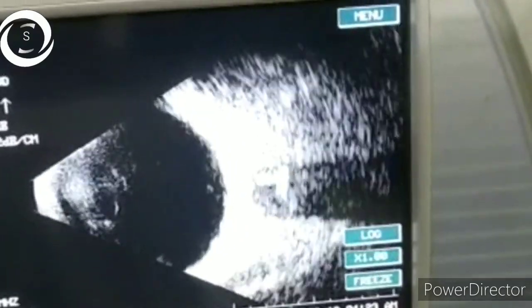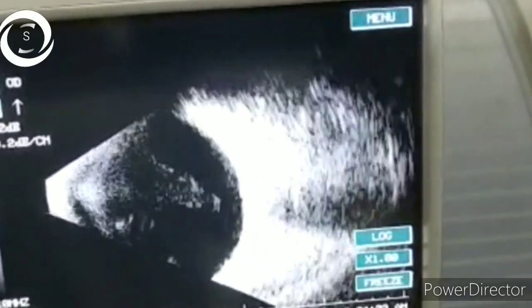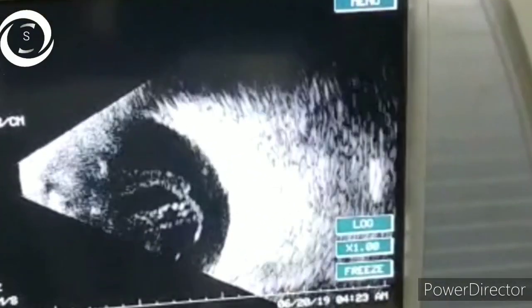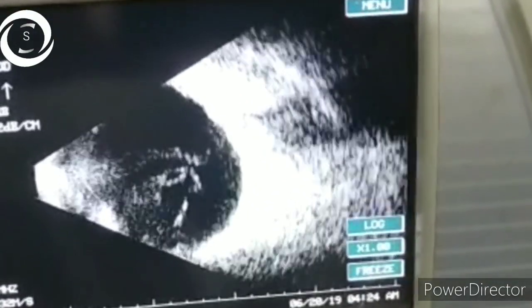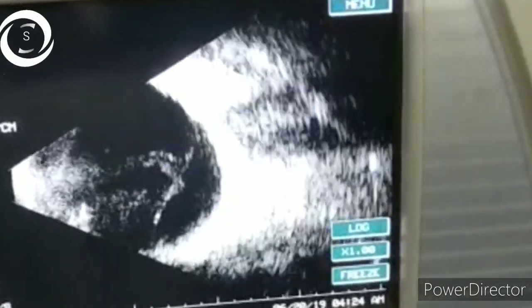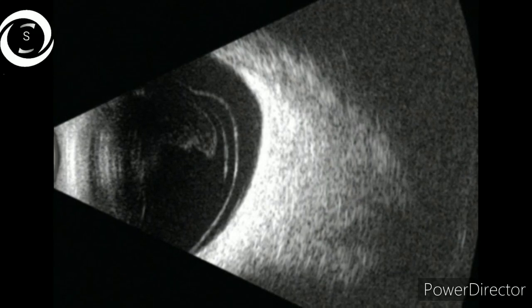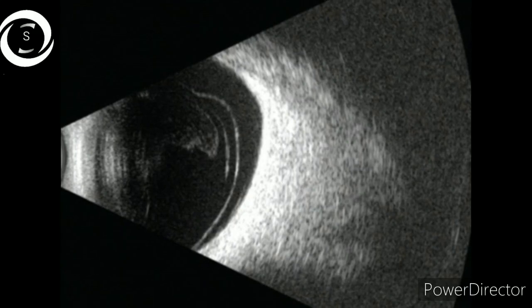The membrane is sometimes very thin, sometimes very thick, showing uneven thickness. The undulating movement after probe movements confirms that this is posterior vitreous detachment. You can observe it is attached to one side of the disc, so this is an incomplete PVD.